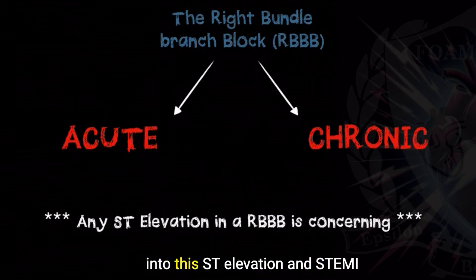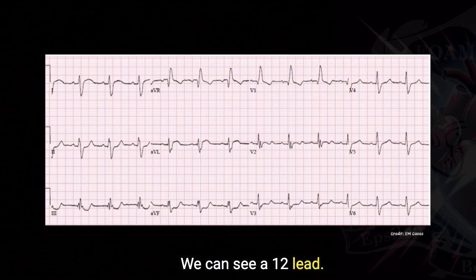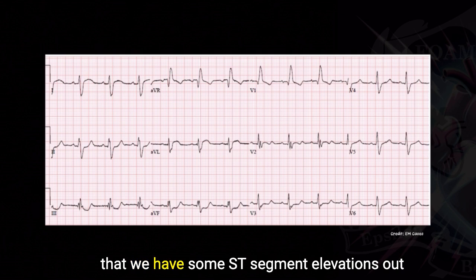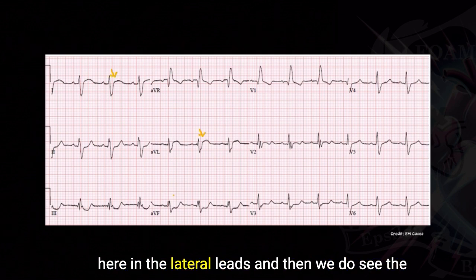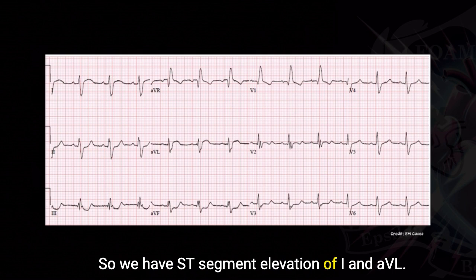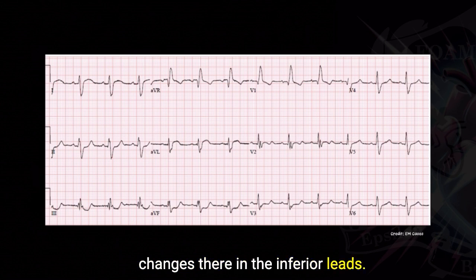I wanted to dig a little bit more into ST elevation and STEMI in a right bundle branch block. Here's an example — we can see a 12-lead that looks otherwise unremarkable, but we do notice some ST segment elevations out in the lateral leads, and we see the reciprocal changes out in the inferior leads. We have ST segment elevation in AVL — it's a lateral STEMI, with reciprocal changes in the inferior leads.